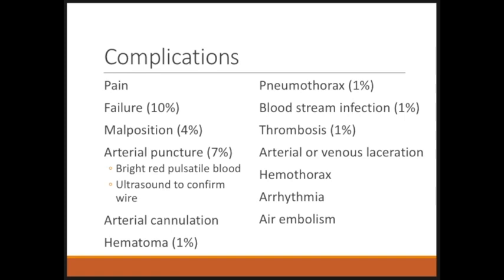And if you do get atrial or ventricular arrhythmias, you can just pull back your wire several centimeters and the arrhythmias terminate spontaneously the vast majority of the time. And during the procedure, especially with high lines, always Trendelenburg the patient so their head is below their heart, so your needle puncture site will be less likely to have an air embolism.